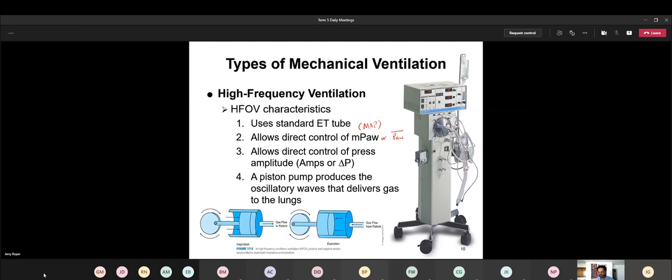Don't look at one of these and say, I know that my patient is receiving 40% because that's what it's pointing to right now. You're going to have to use an O2 analyzer, because this machine doesn't have a built-in one internally like the other machines do. Once your O2 analyzer is set up, you'll have to connect it in line somewhere, usually on the heater, where the circuit is connected to the heater.